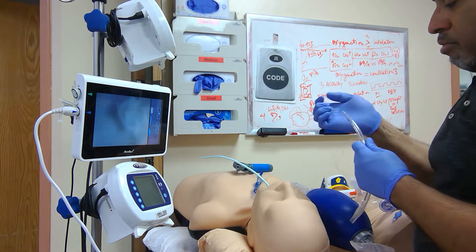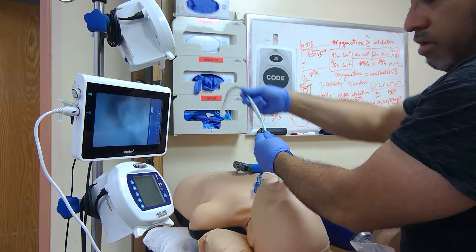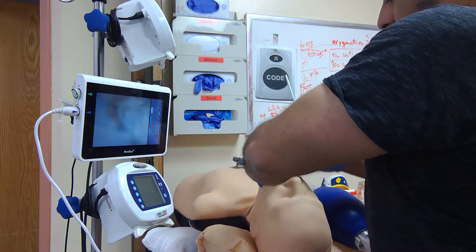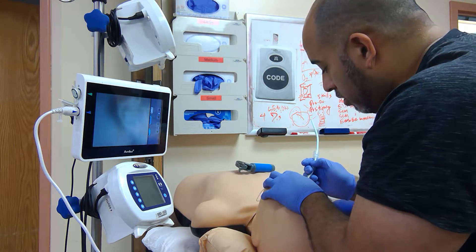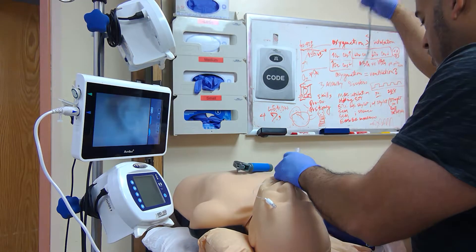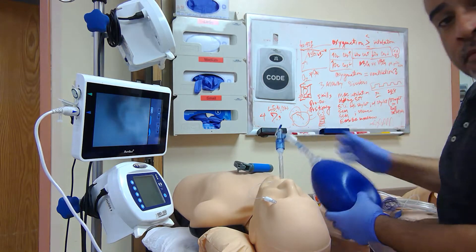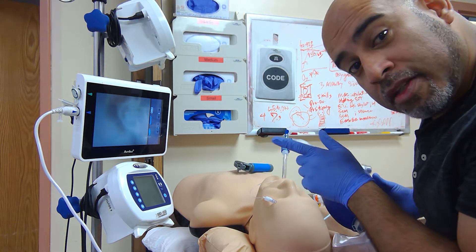Have the tube that you desire — 7.5 or 8.0. Move the tube, advance it over, do a jaw pull. That should have advanced to the desired lip line at 22. And that's how you use the LMA to intubate patients.